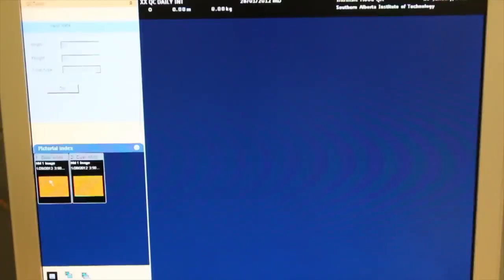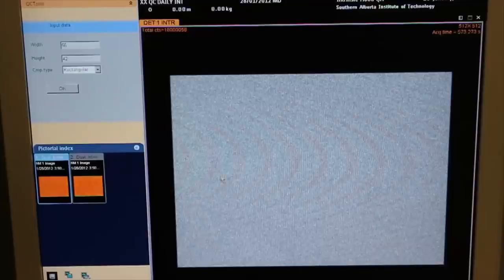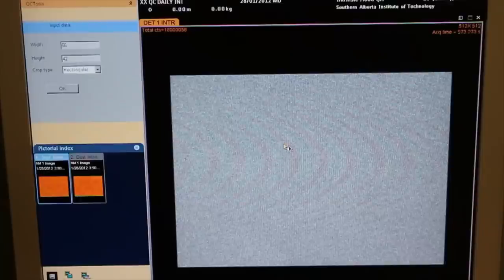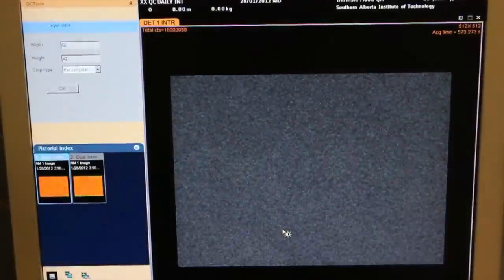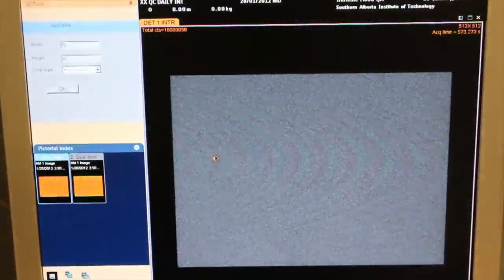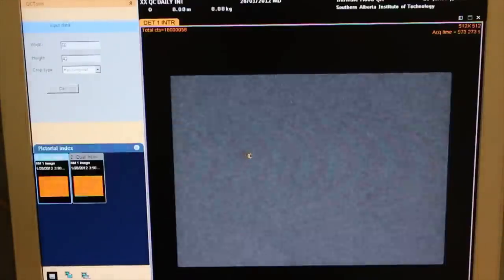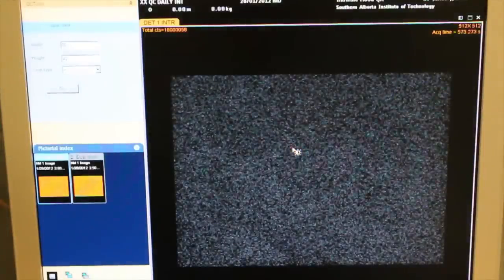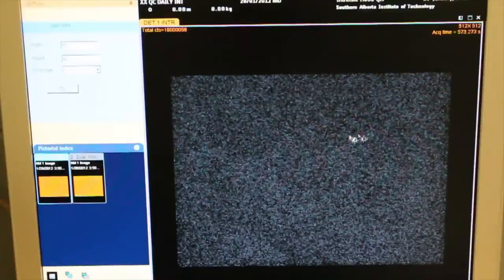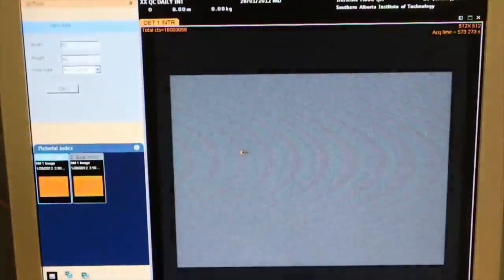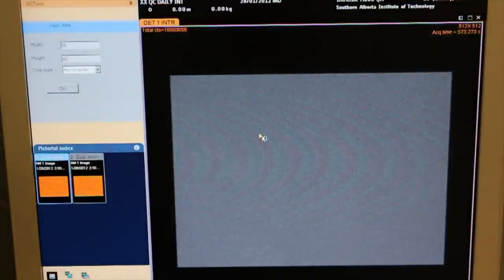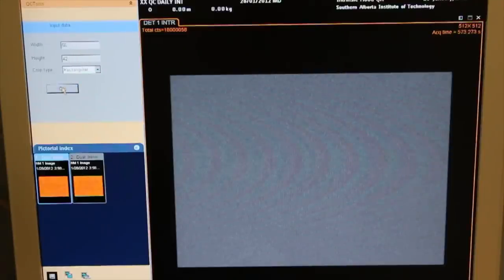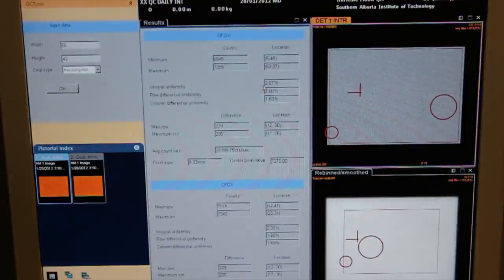Select Detector 1 image and begin the qualitative analysis by right-clicking and selecting Gray Level. Scroll to remove overall intensity and background intensity. Identify areas of lower and higher counts. Return intensity to normal and observe if the higher and lower count areas are blending back into the image. Confirm that the area of the analysis for uniformity is correct. Press OK.